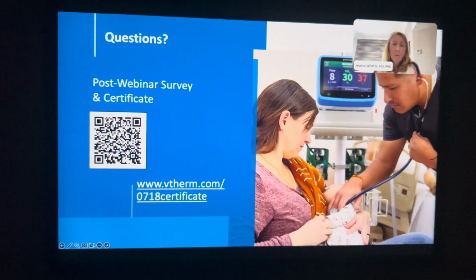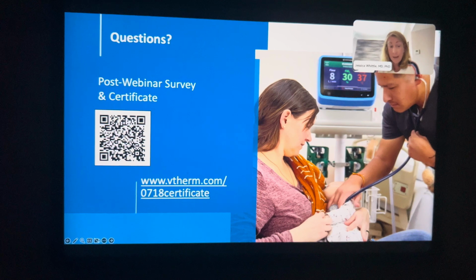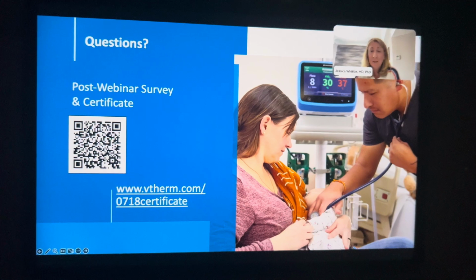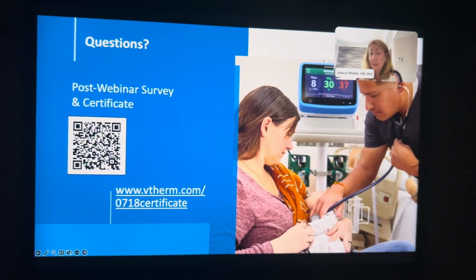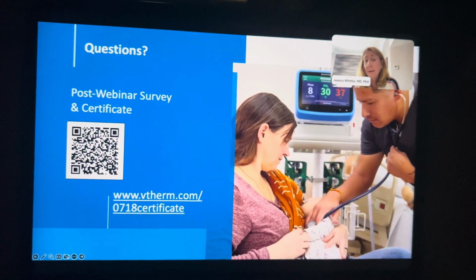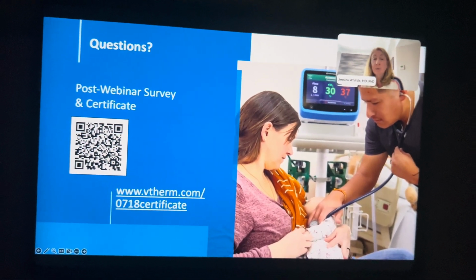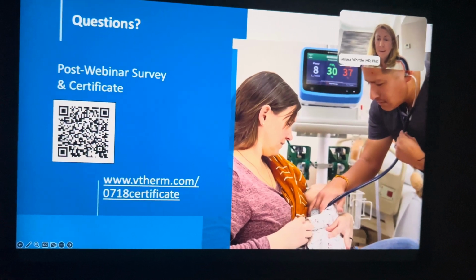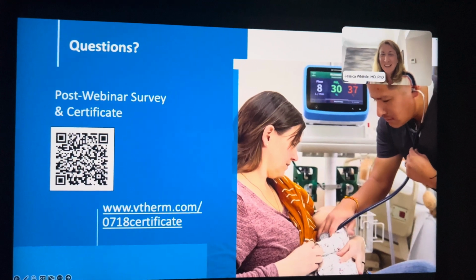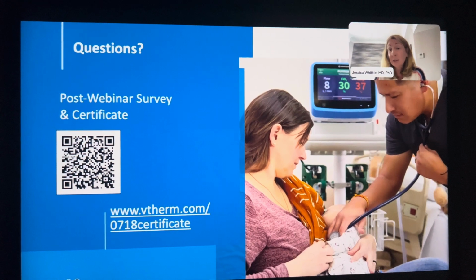So just be thoughtful, and that's exactly the experience the clinician that I worked with yesterday had. He had tried a larger bore system and said, it didn't blow off CO2 very well, so we tried with this, and it was a completely different experience. So just be very mindful of your patient, mindful of the type of system that you're using, and I would encourage that you do it, but obviously the computers and robots aren't replacing all of us yet. We still need to be quite thoughtful in how we care. It's not a perfect solution for every patient, but it's a great solution for many of them.